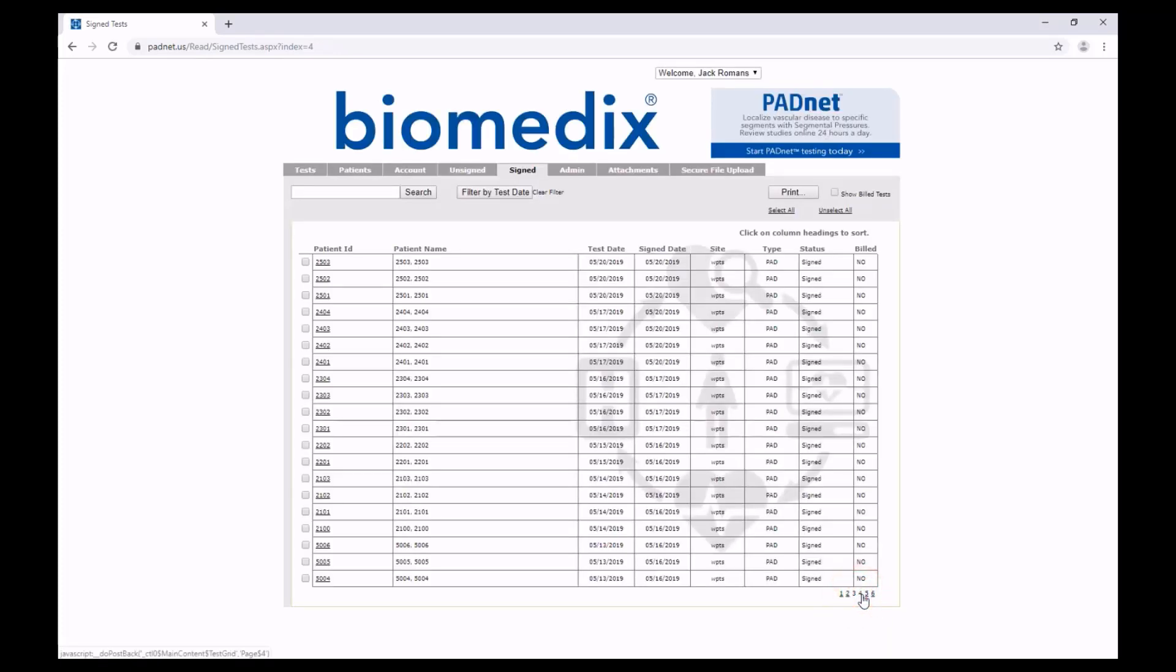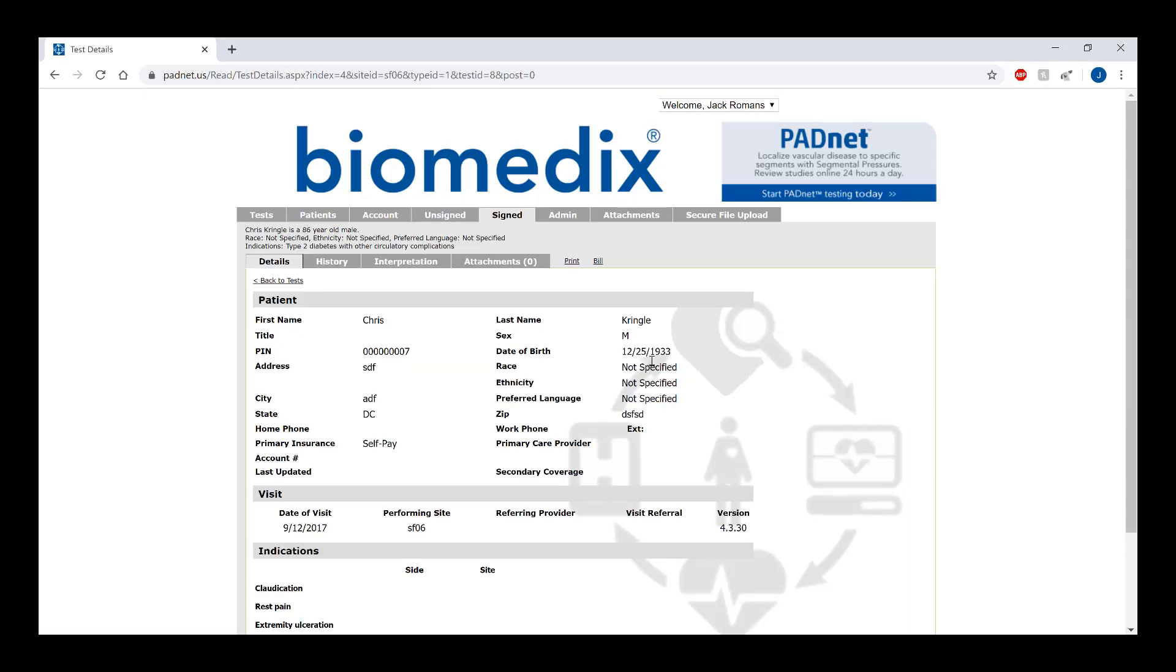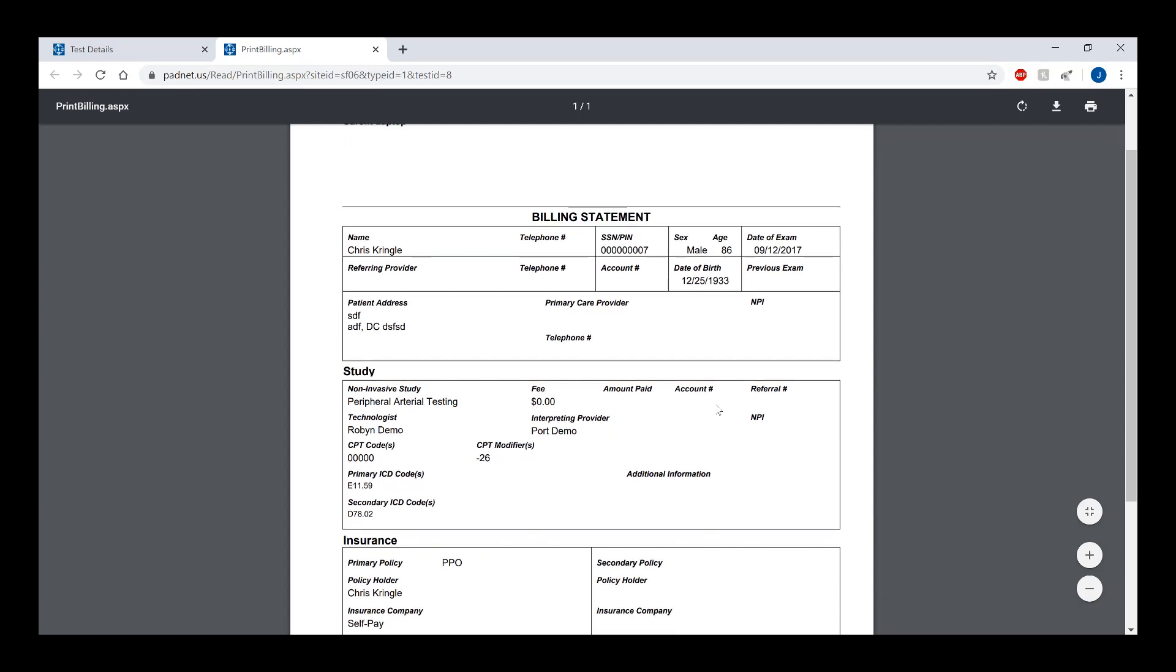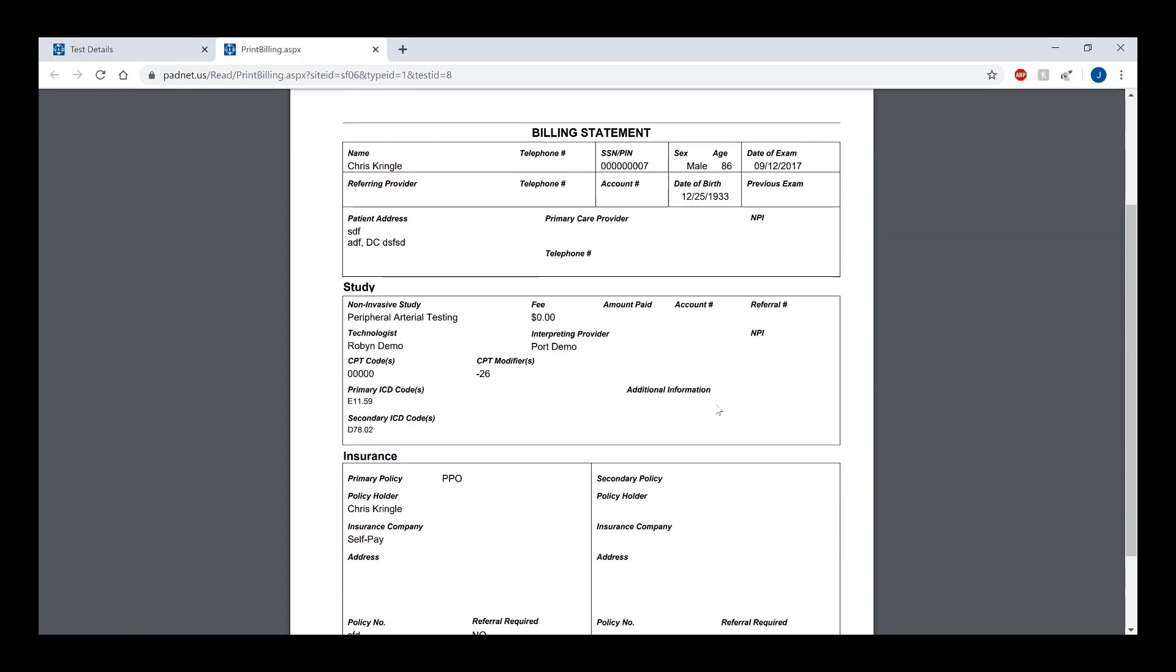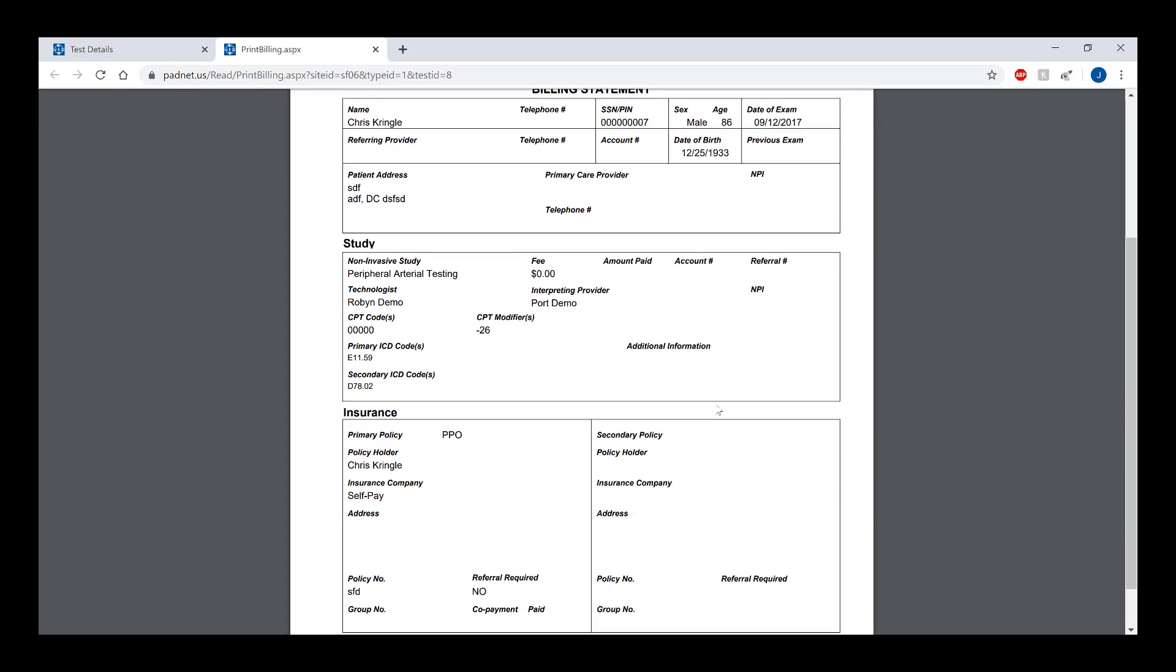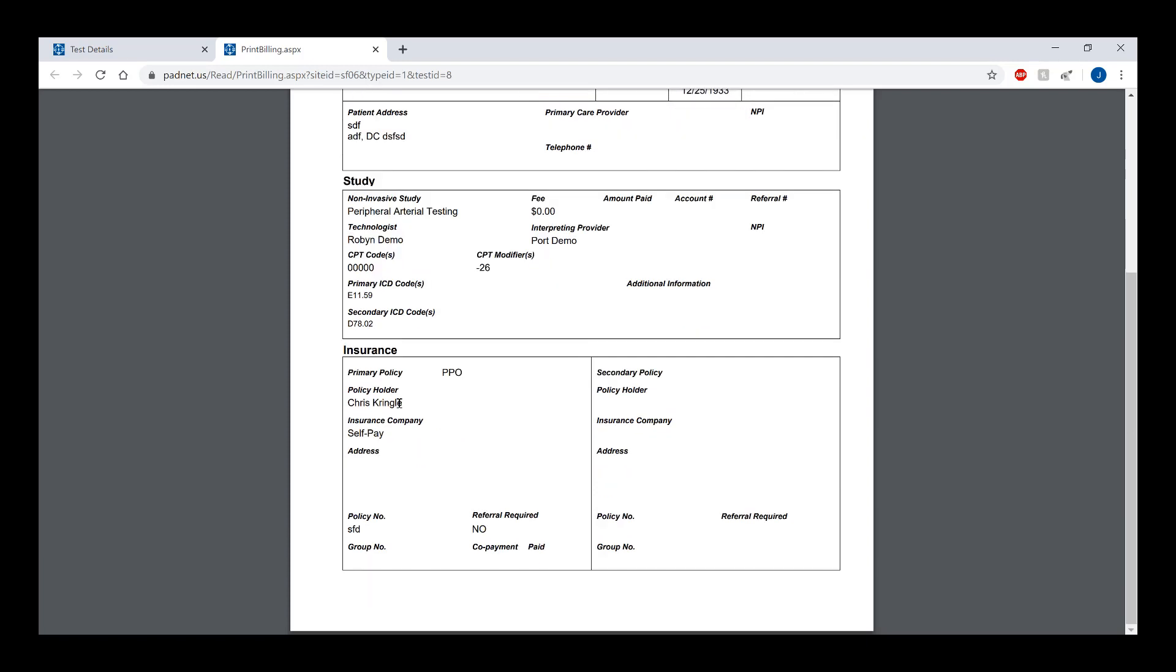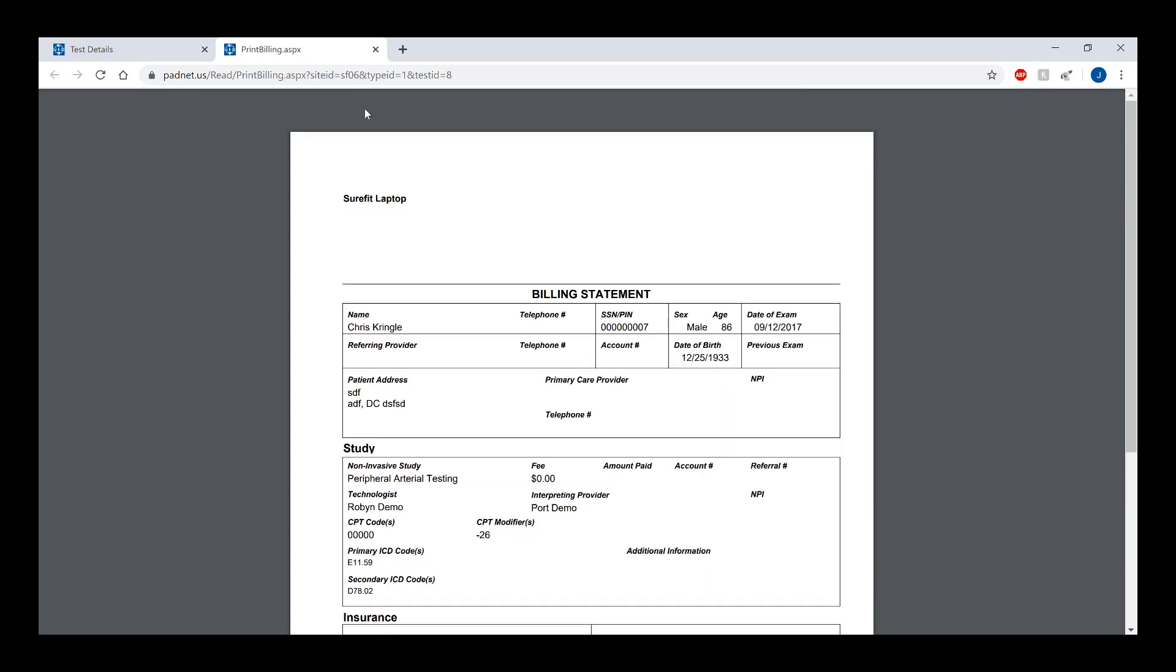If you wish to find a test that has been billed, you can show your total history of signed tests by clicking the Showed Billed Tests button. To bill a patient, click on their patient ID and find the Bill hyperlink at the top of the page. Once you click on this, a report for the billing statement will appear in the next tab. On this tab is where you can find their insurance information, as seen in the box below. Once you've clicked on the link that creates this report, the test will only be viewable when you click the Show Build Test box in the Signed Test section.